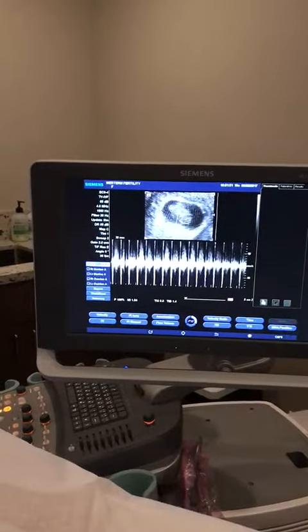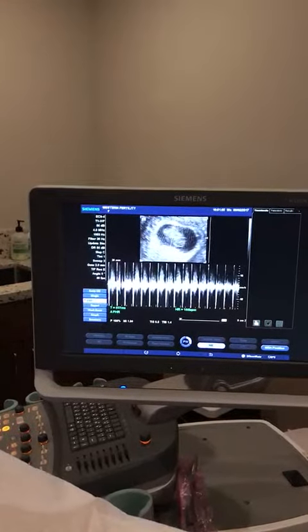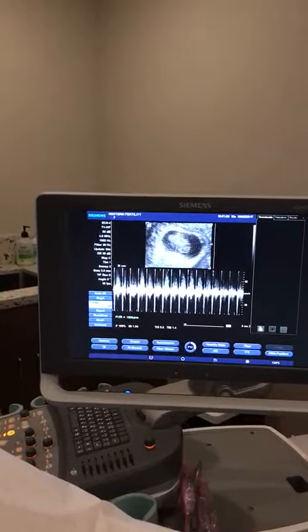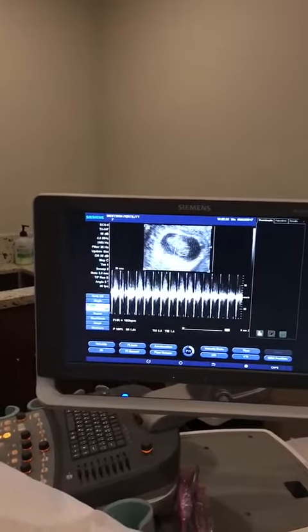The heartbeat is very strong over here. We want it between 150 and 180 — it's right up at 180, so it's perfect.